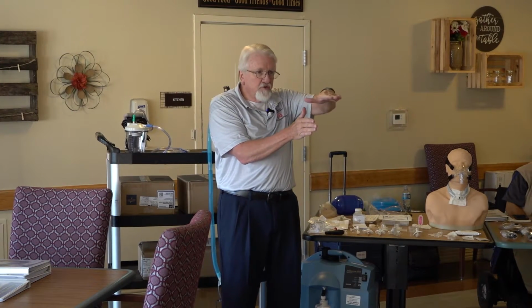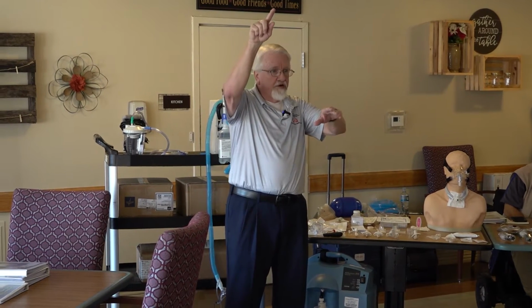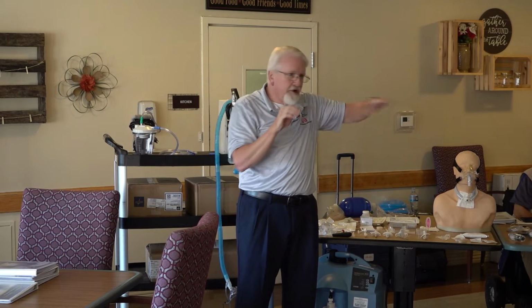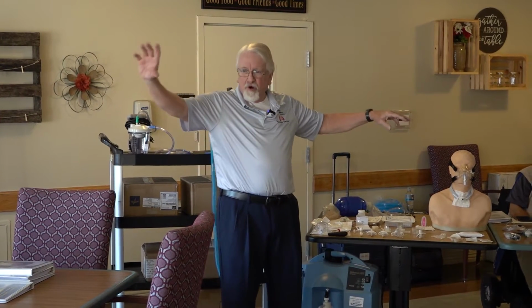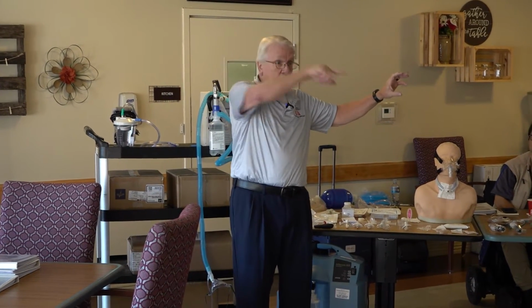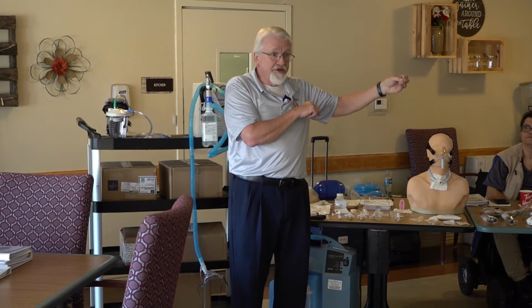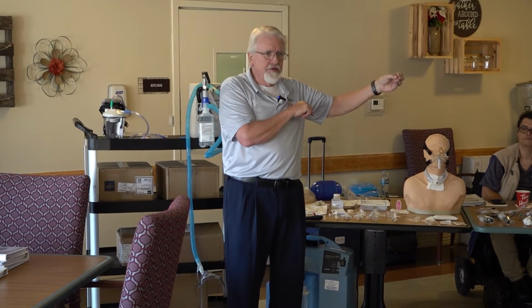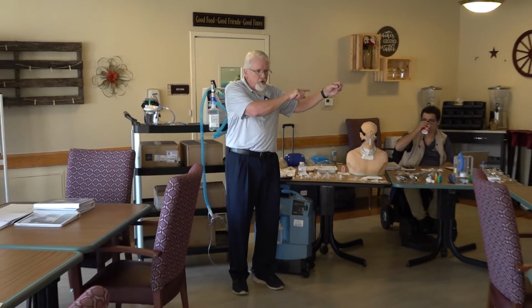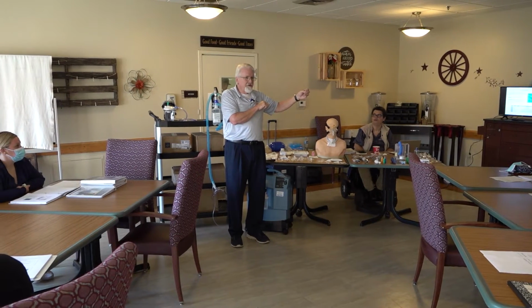Well, as it's doing that, it's creating a vacuum, and it's getting room air from here and room air from here bleeding into that 100% oxygen. So over here I have 100%. Here I have 100% plus 21 plus 21, which is diluting it. So I may only be giving 70% over here. Does that make sense? Because I'm diluting it down by pulling in 21% room air. That's what entrainment means.